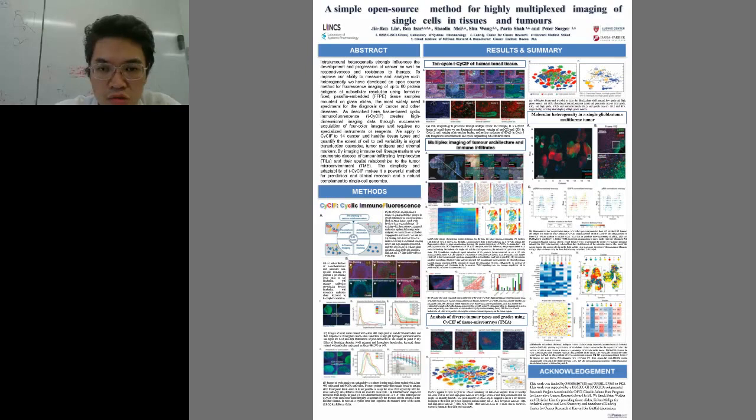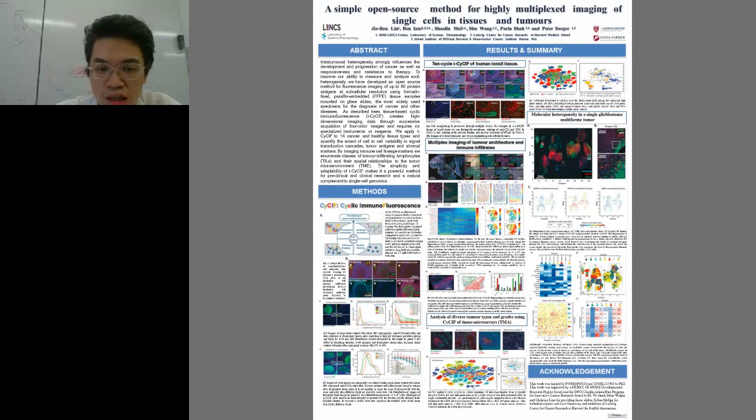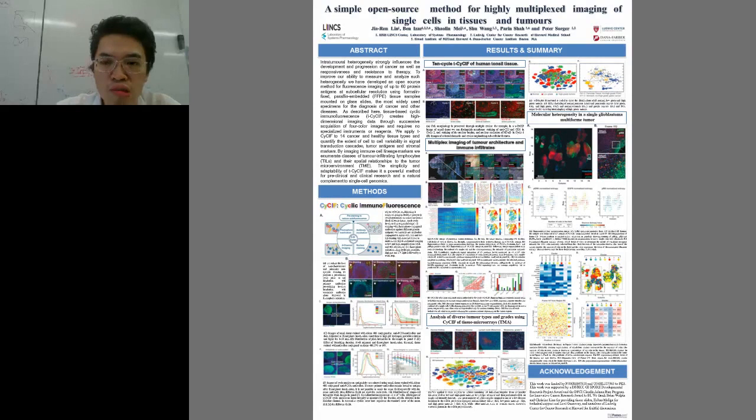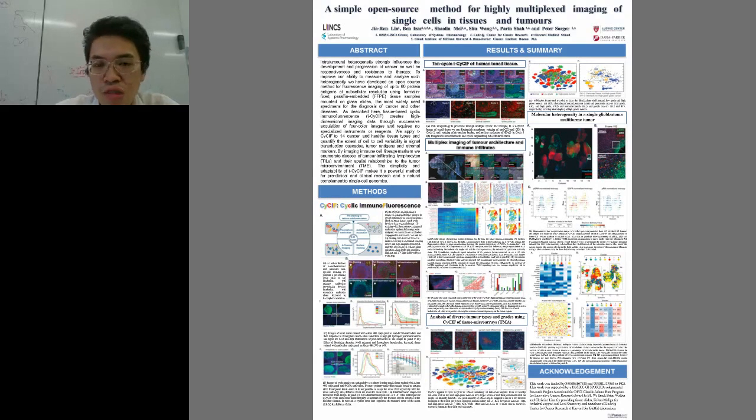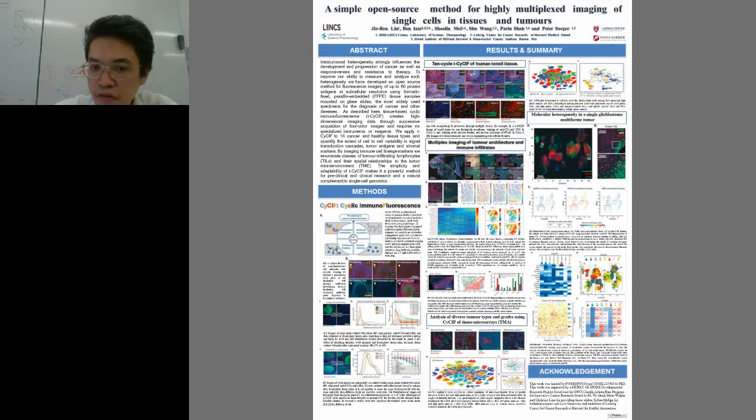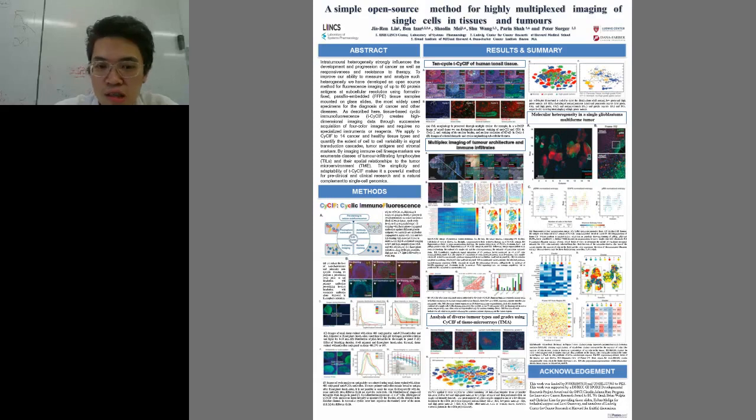I just try to show you a quick example that we have a slide, actually a human tonsil. Before you do the staining, you can start to see some background fluorescence, but it's okay because we record all this information before you stain. After you stain, you can compare before and after, and you can erase all this signal afterward and then stain again with a new antibody. Now you can start to see all the changes in the staining pattern, and you can do this so on and so forth.